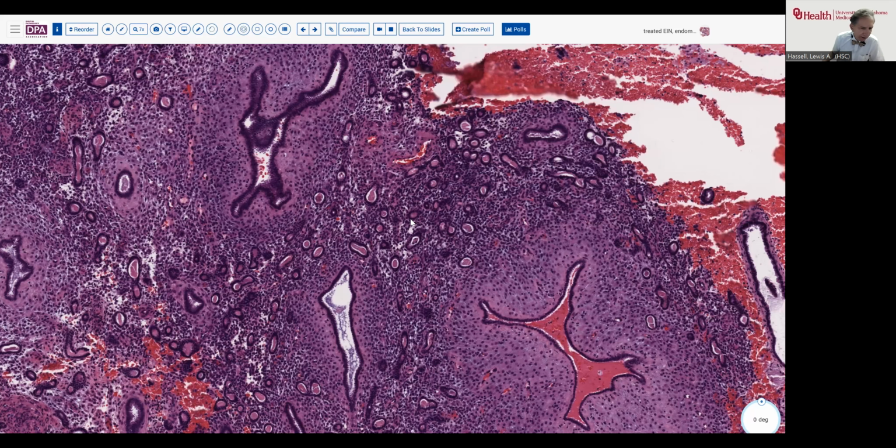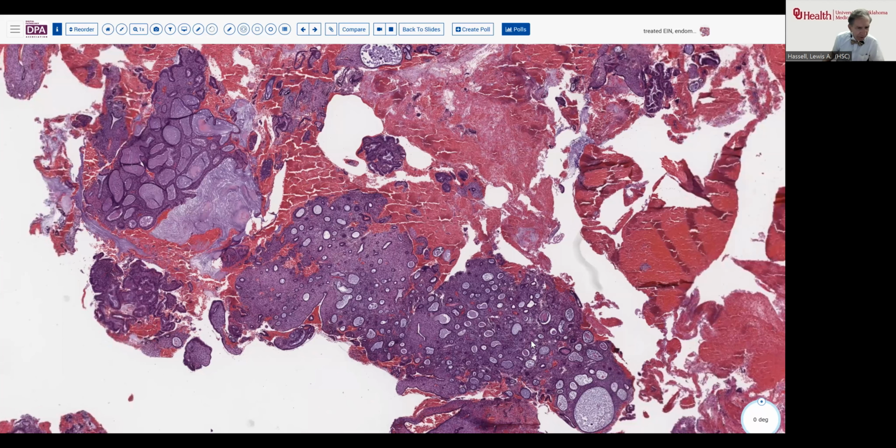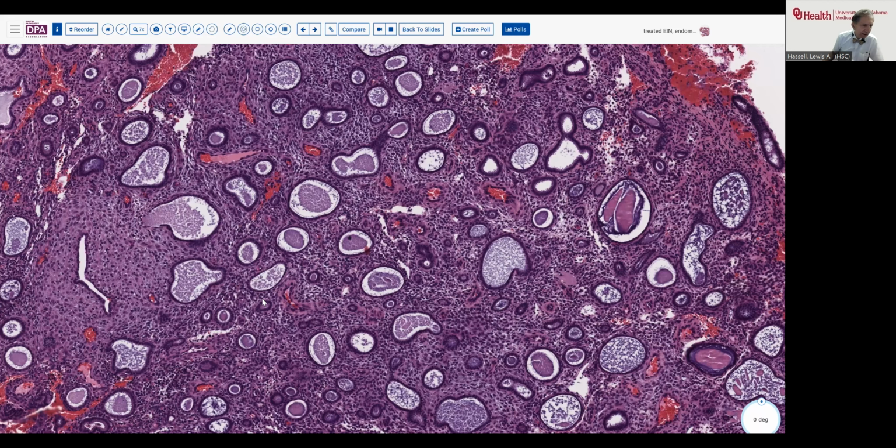We'll come back to another fragment here. And let's look at these two fragments here. So here, we see not atypia, but we do see architectural prominence of these glandular tissues. So this indicates that there's some degree of residual architectural change. Now this may be a polyp. We have some vessels here. And so this may be just an area of simple hyperplasia, because there's certainly no cytologic or structural abnormality to these glands here.